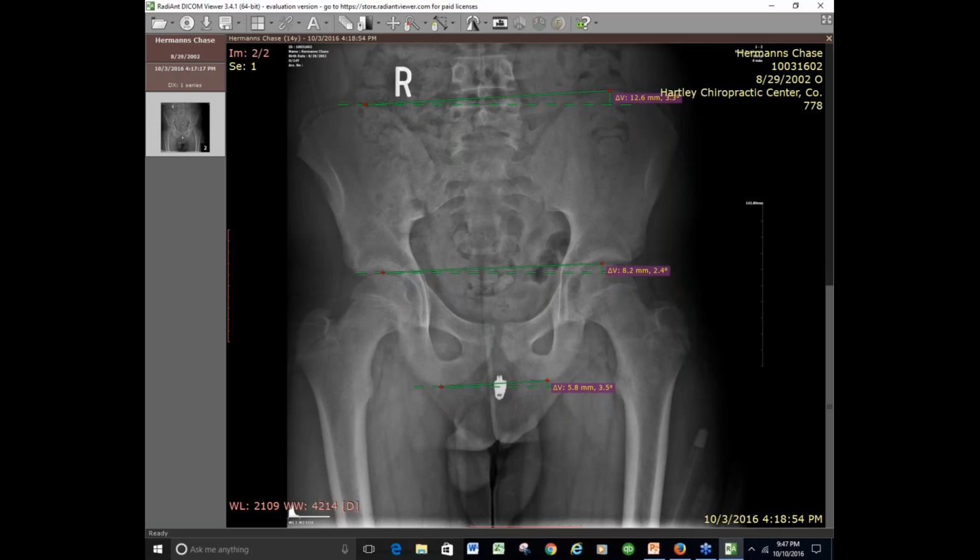All right, any questions on that? There's a physics reason why it blows it up. It always makes it larger. It doesn't make it smaller. It has to do with what the incident angle is when it hits the leg and all of that stuff. You guys are welcome to research the physics of that yourself, because it would take a long time to explain that. And I haven't done physics since college.